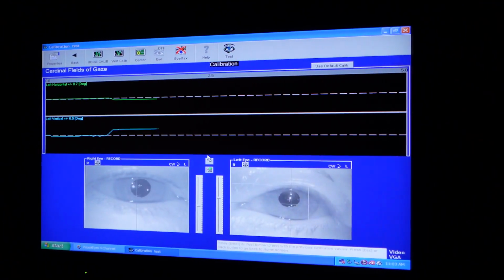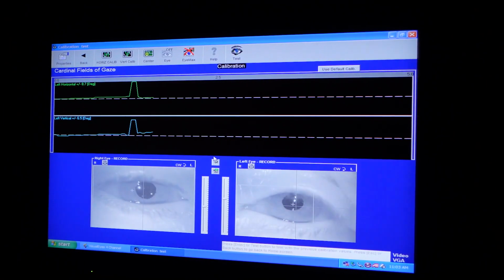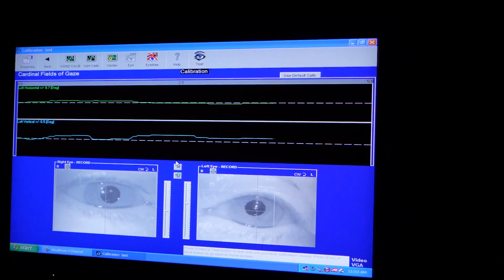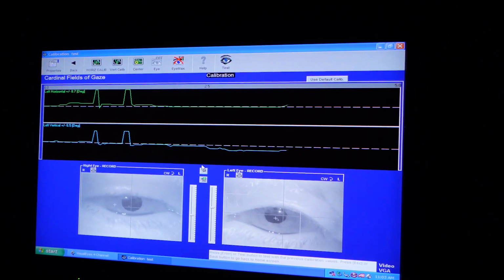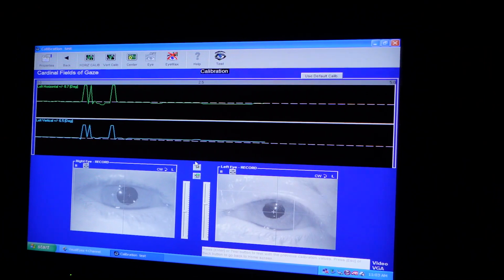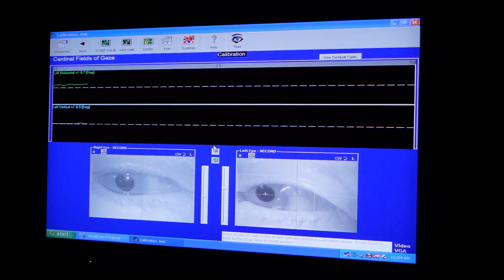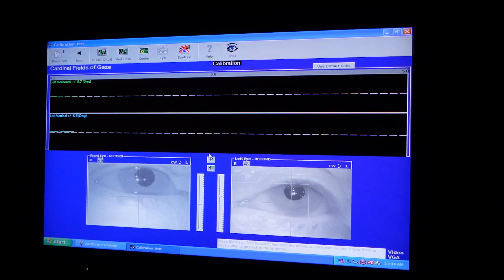So one of the things that is done with a normal vestibular type of exam is you have a person put on either the goggles I'm using, which allows them to not see through them, and then have infrared cameras that are picking up their eye movements. Or you can get very inexpensive equipment called Frenzel goggles, and the Frenzel goggles are goggles that they put on where there's a hazy tint to the goggles, so you can see their eyes, but the patient can't really fixate on a target. It's too blurry. And that takes away visual input. So that really allows the vestibular pathways to express themselves.